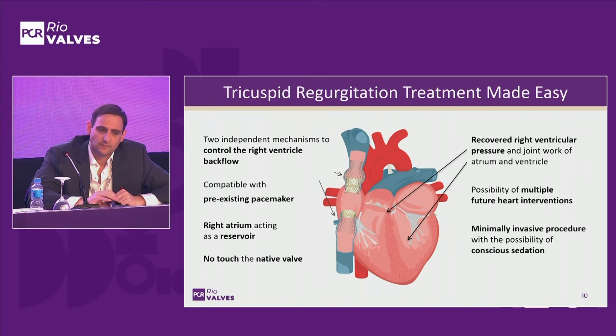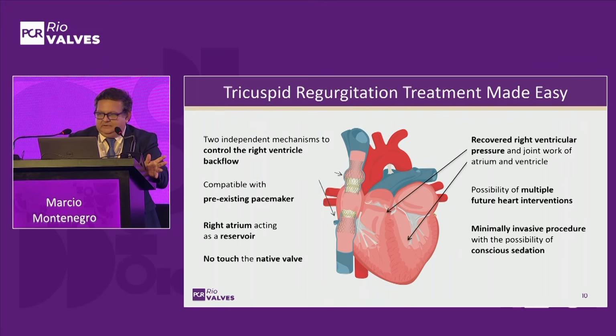Yes. No touch of the native valve. We can think that we can treat the valve further. Recovery of right ventricular pressure and joint work of atrium and ventricle. Possibility of multiple future heart interventions, it's possible.